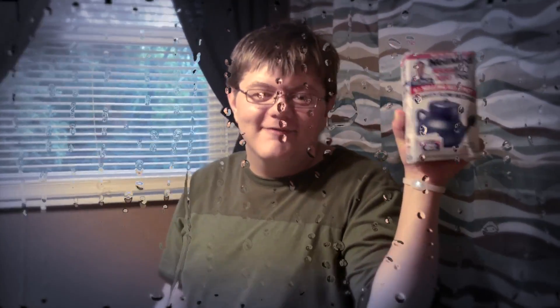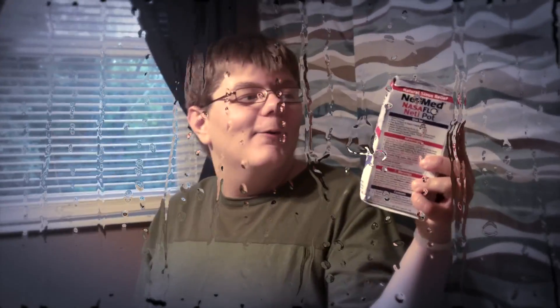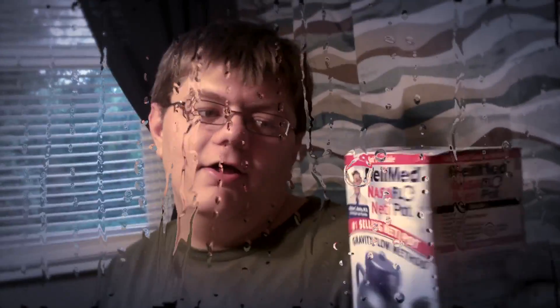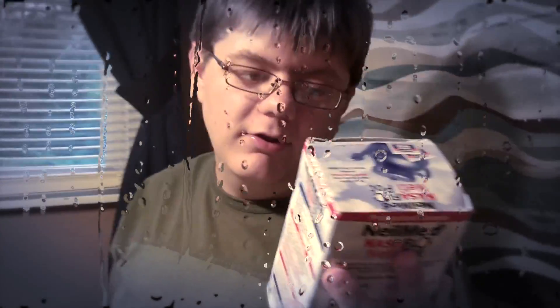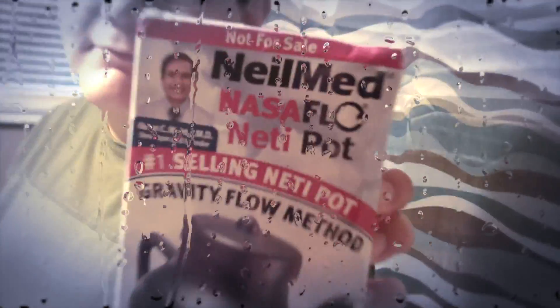Hello and welcome to a Charon134 video. Today we're going to be doing this thing called a NeilMed NasaFlo neti pot. I believe that's what you shake in there — sinus rinse. Looks like that, and it says NasaFlo.